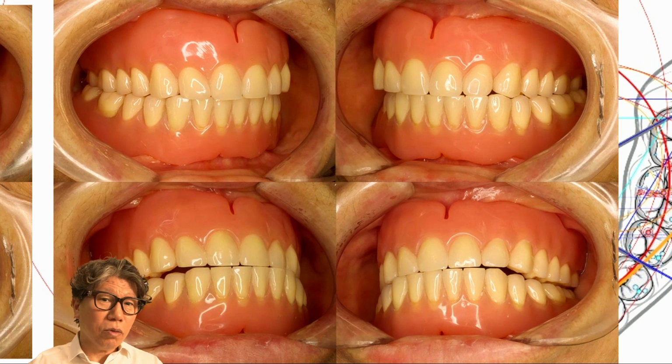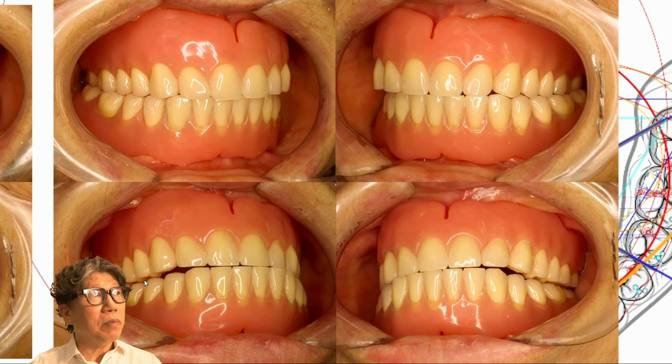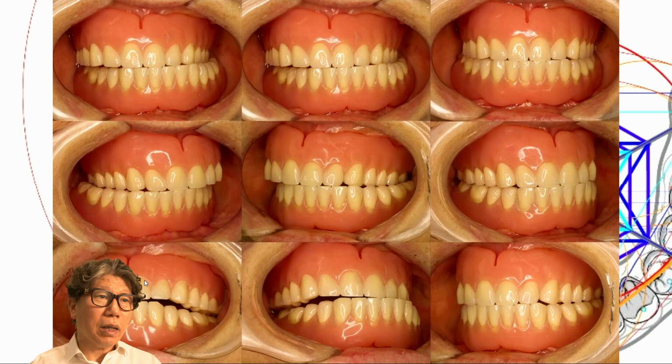This patient is also quite an old patient, and it's been about 10 years since he got dentures, but he continues to use them well. He only comes for checkups, and this patient is quite advanced in age. He is in his late 80s to 90s. There is absolutely no problem, so I don't think there will be any need for further special treatment. You haven't come for about 2 years. I'm curious if you've been well. In any case, it should be ensured that it can be used for a long time without issues.